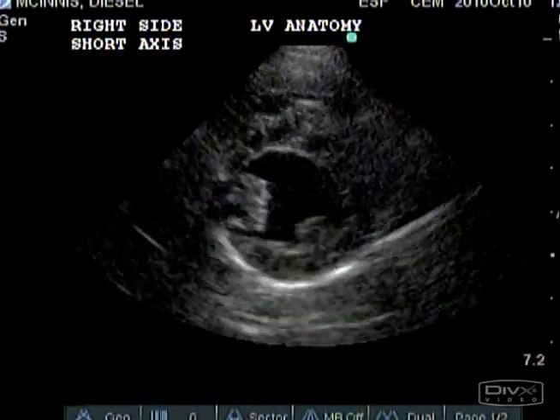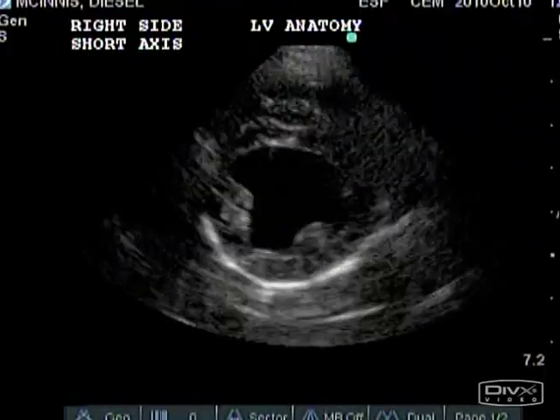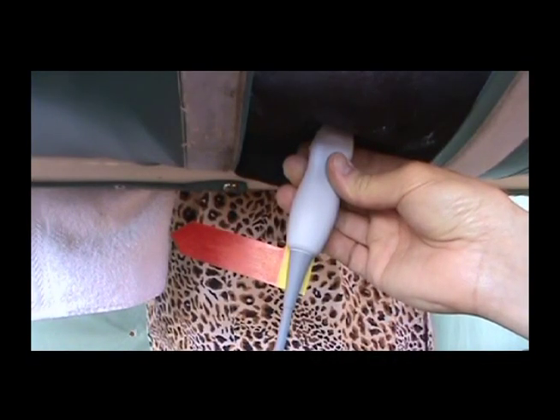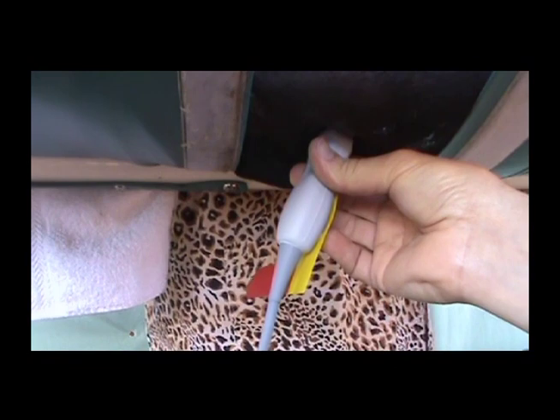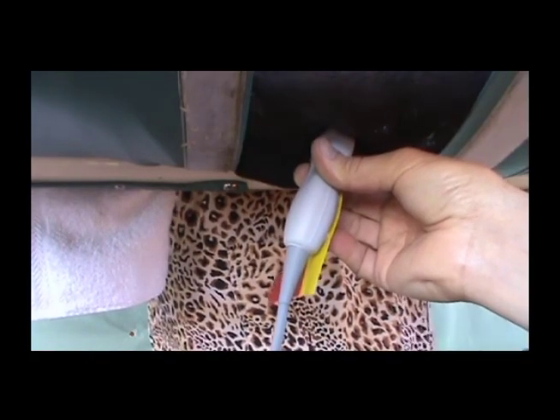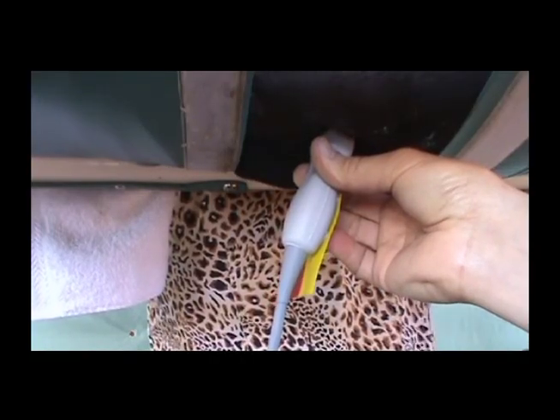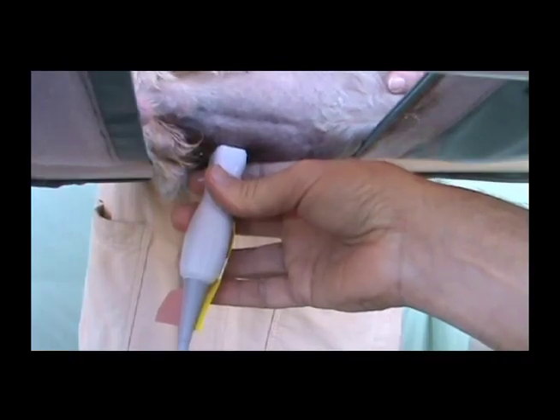When you have finished your tumor check, return to a right side short axis view of the left ventricle. The transducer is still perpendicular to the right thorax. Rotate the transducer 90 degrees clockwise. The transducer index will now be facing away from you and toward the patient's vertebrae, or dorsally. Using the clock face analogy, the transducer index will be pointing between 11 o'clock and noon.